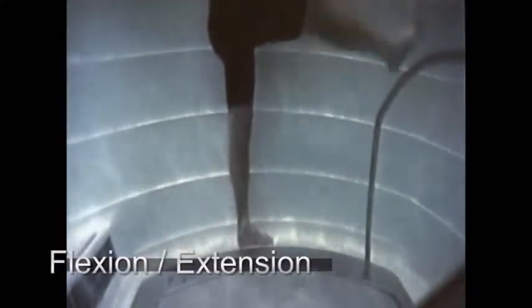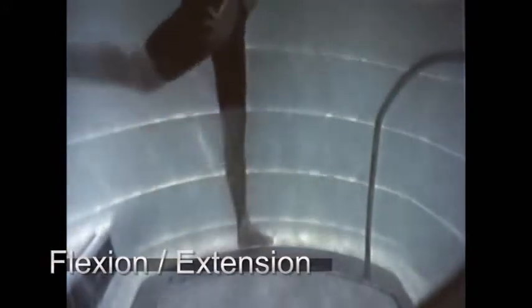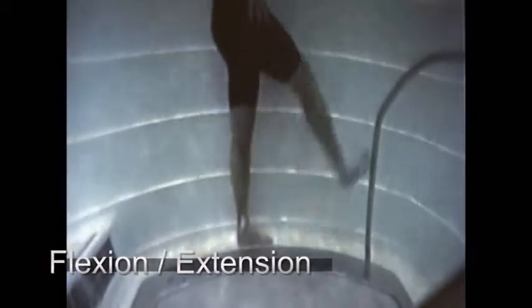The first thing I would do for an athlete is to get them to use the HydroWorks, which is usually the first thing I have them do when they come into the training room — have them work on range of motion. But first you've got to get them warmed up, so I have them walking a little bit just to get warmed up, get comfortable, and then just going through a comfortable range of motion. It's stressed that everything is pain-free range of motion, and once they're in there for 10 to 15 minutes, usually the range of motion increases quite a bit — and that's the idea behind it.